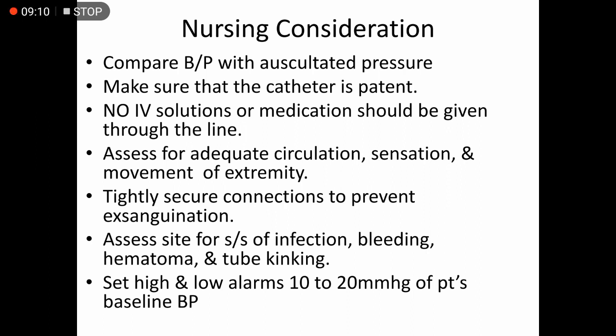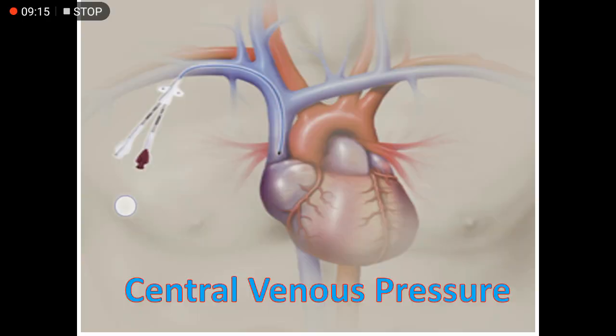Set high and low alarms 10 to 20 millimeters of mercury from the patient's baseline.